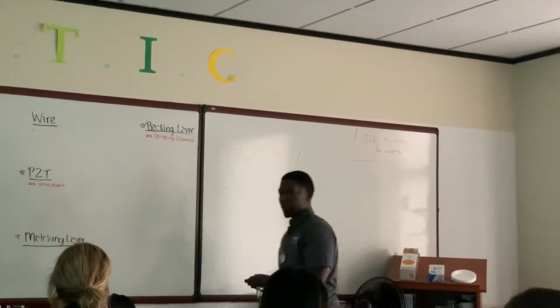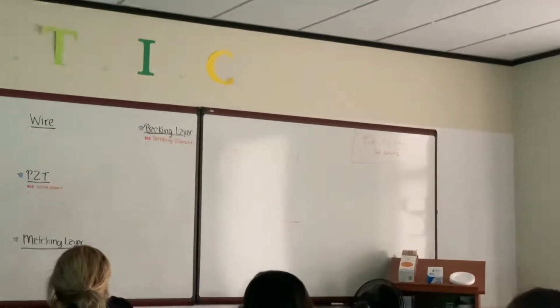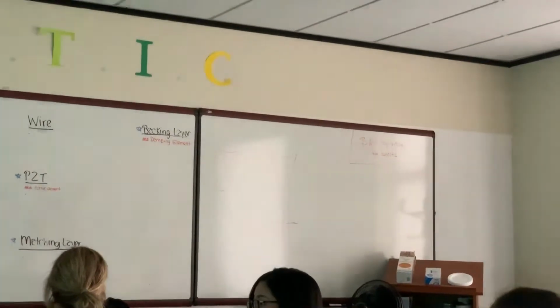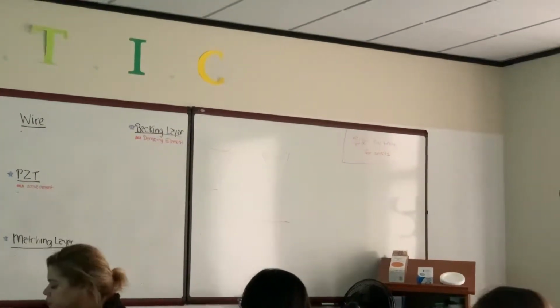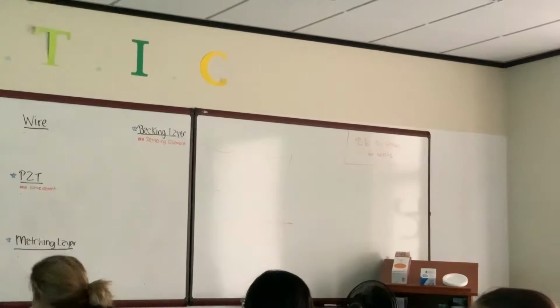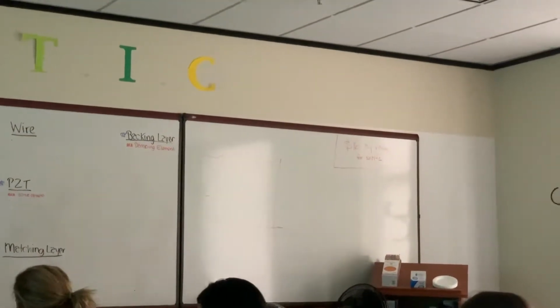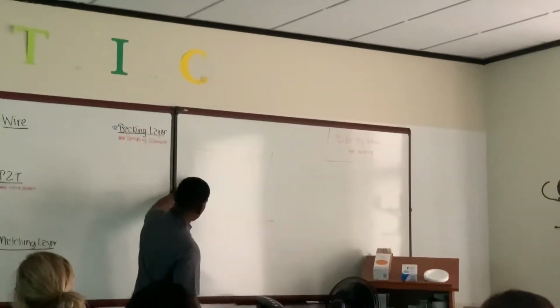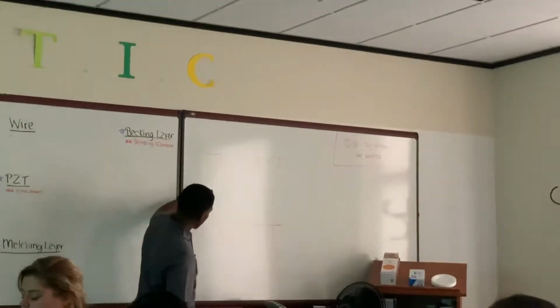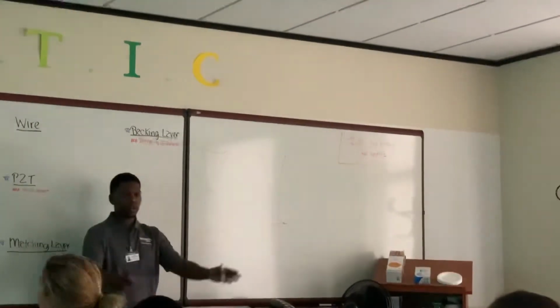And you see, now my focal depth is different. I'm actually changing the shape of the hourglass, basically. Either I'm making it extended or I'm making it shorter, depending on where I put my focus, which is why having the movable focus is so important, because we don't want any of our image to be in the far field. We don't want it to be where the beam diverges. In the focal zone, this is good, but we don't want any of our image to be in this area, because that's where the beam diverges.